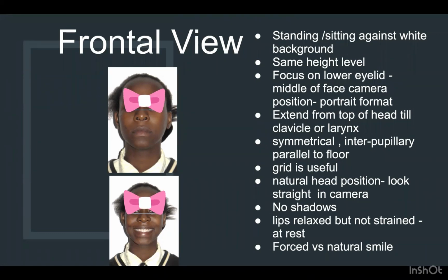And tell patient, don't look at me, look at the camera, okay? You have to look straight in the camera, okay? The camera can go up, the camera can go down. The focus on lower eyelid, middle of the face. When you're doing the face picture, your cursor should be lower eyelid and the middle of the face, okay?